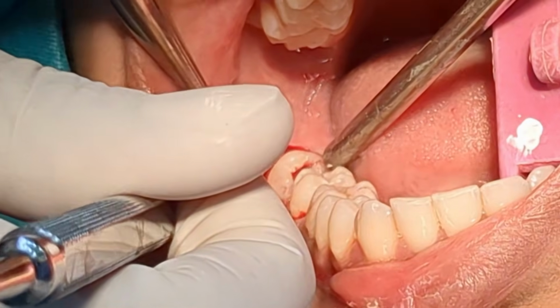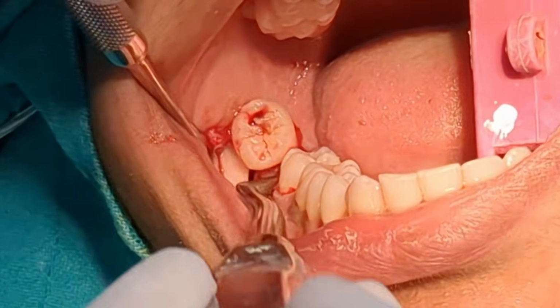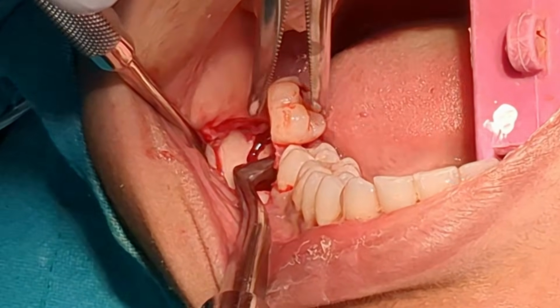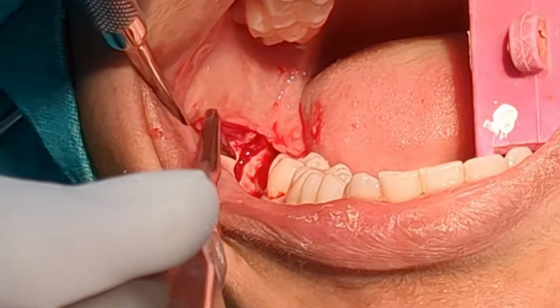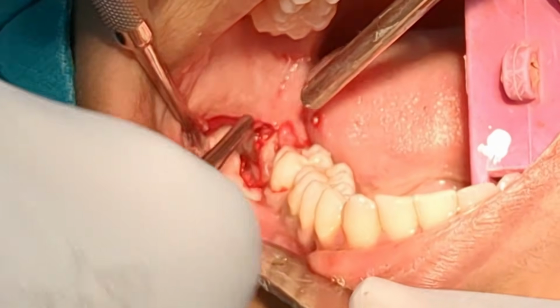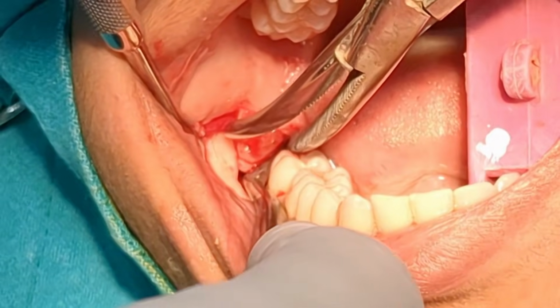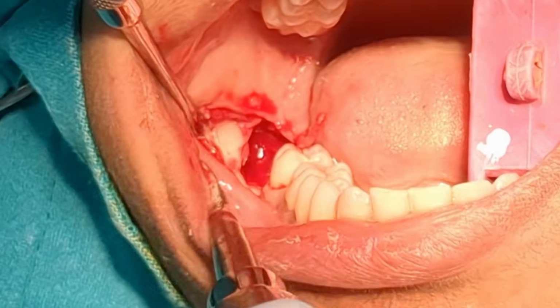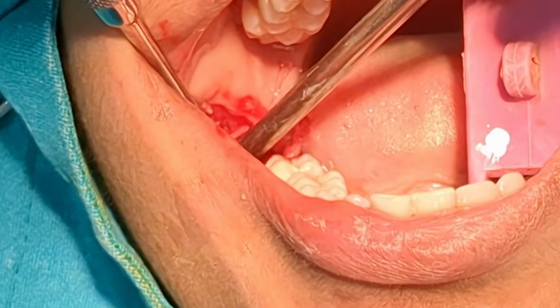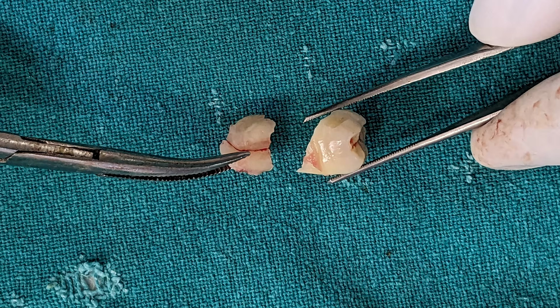I then fracture the tooth at the section using a coupland elevator. The sectioned crown is then elevated with a Cryer elevator and removed with the artery forceps. Similarly, I elevate the roots with a Cryer elevator and remove them with an artery forceps. The flap was sutured with 2 interrupted sutures. This is the sectioned tooth.